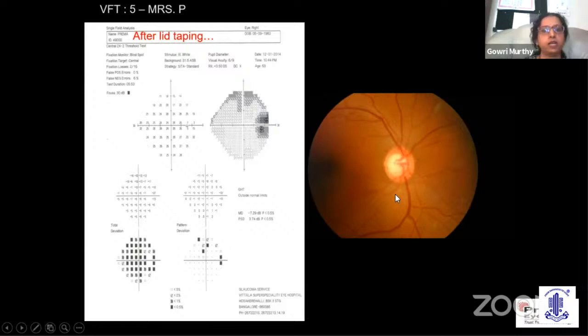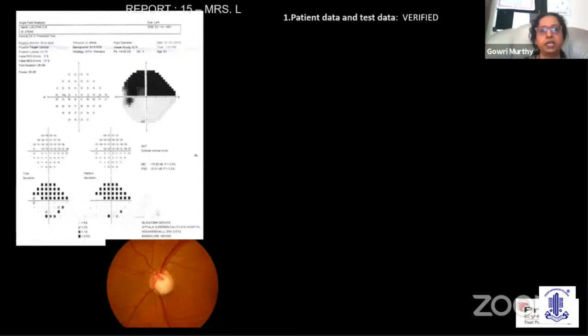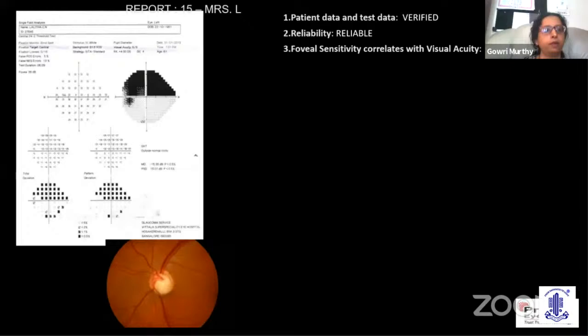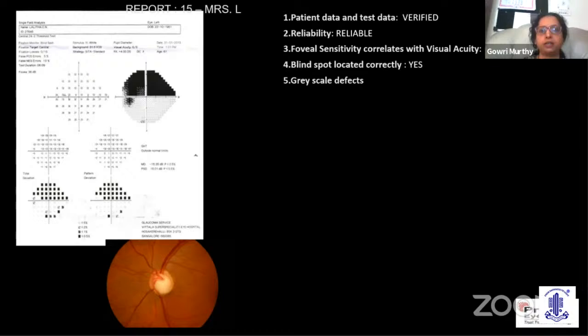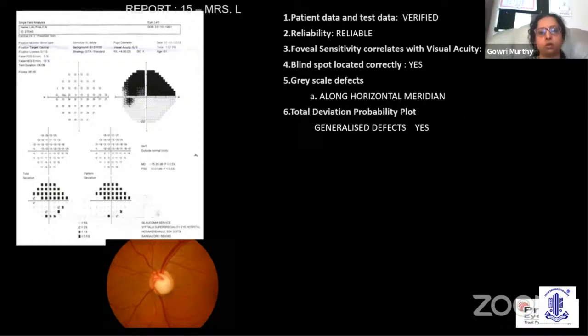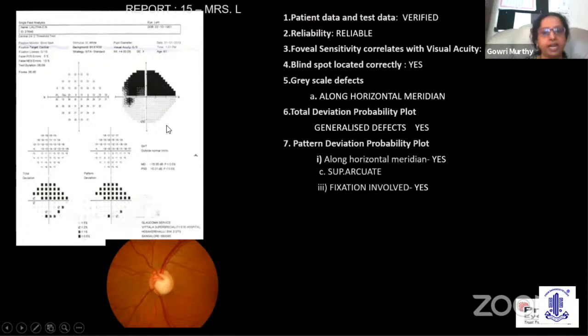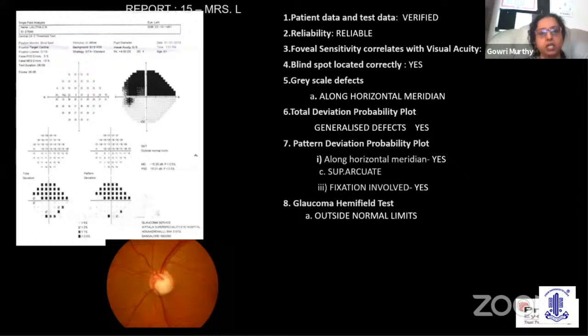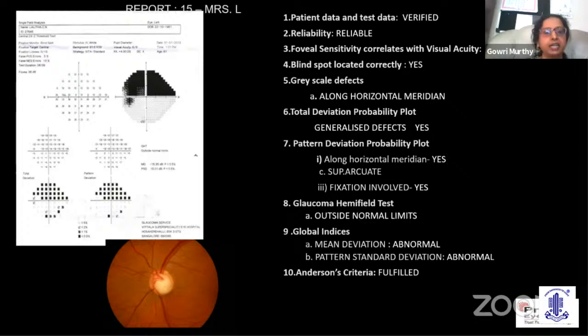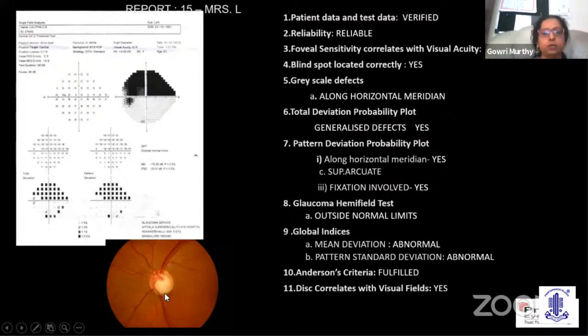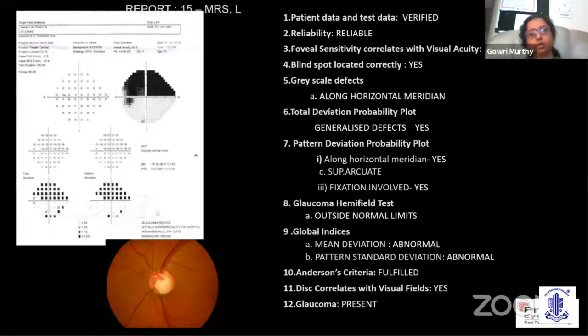In the next visual field, patient data is verified, the test is reliable, and foveal sensitivity correlates with visual acuity. The blind spot is located correctly. The grayscale defect shows a superior defect respecting the horizontal meridian. The TD and PD plots are very similar, showing only localized depression in the superior hemifield. Is fixation involved? Yes — it is very near fixation, with these two points showing single digit numbers or zero. This patient should preferably undergo 10-2 testing to look at the central 10 degrees in more detail. The inferior rim loss on the disc correlates with the visual fields, confirming glaucoma is definitely present.